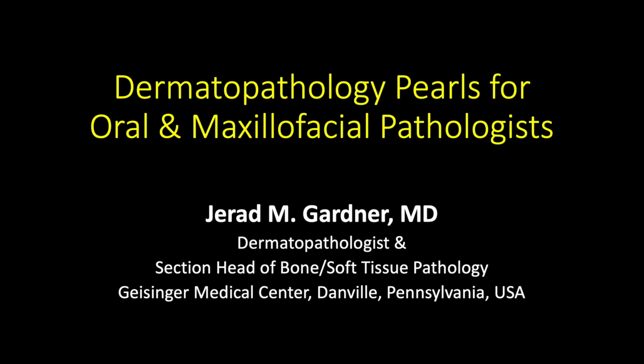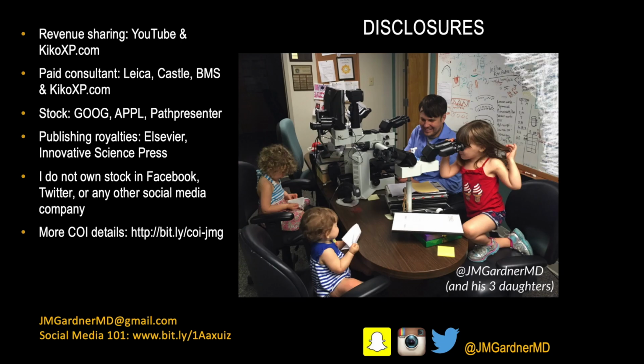I'm going to talk about some dermatopathology pearls with a focus on lesions that arise in the head and neck, so that hopefully it will be helpful to those of you who are oral and maxillofacial pathologists who also see skin.